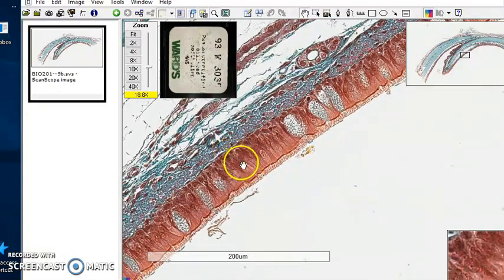It's hard to tell if there are layers of cells in their nuclei or if every cell actually touches this basement membrane. And in fact, every cell touches the basement membrane. So this is a simple epithelium. It has cilia. That's what these little hair-like structures are. So this is a simple pseudostratified ciliated columnar epithelium. And there are other cells in there, classic goblet cells. So in addition to simple columnar epithelium, where you see goblet cells, you also see it in pseudostratified columnar epithelium.